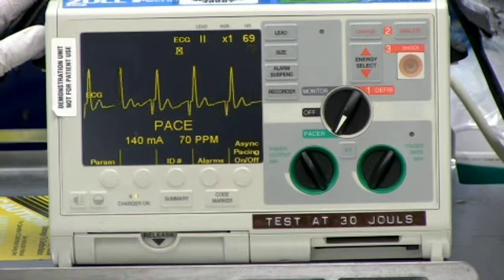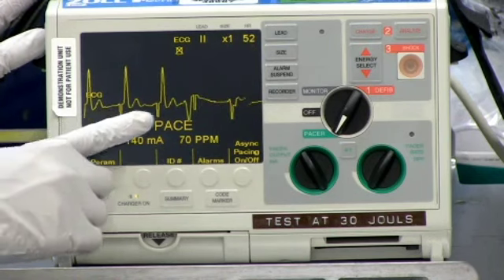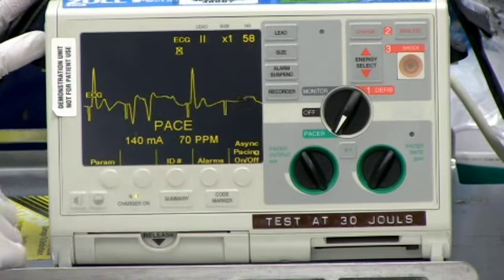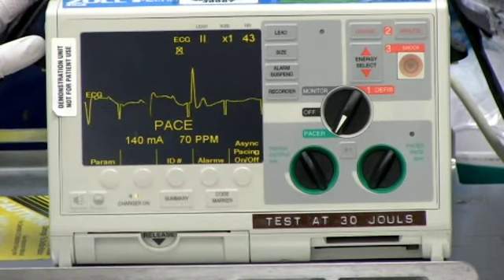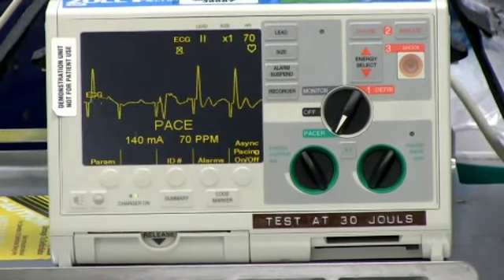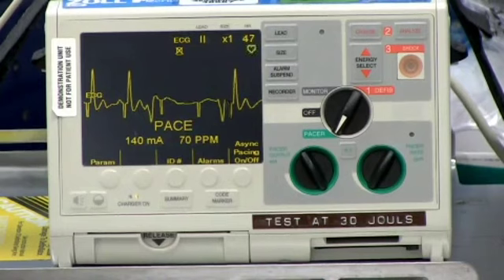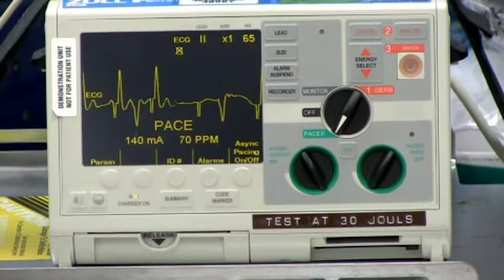The presence of a wide QRS complex after each pacing stimulus suggests, but does not confirm, capture. Cardiac capture should be confirmed by assessing the pulse, blood pressure, and clinical status of the patient.